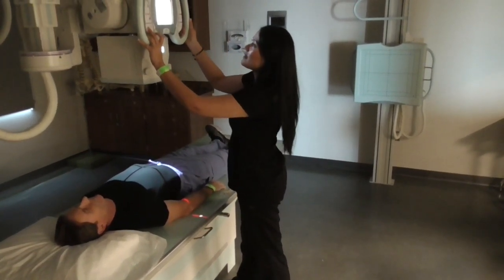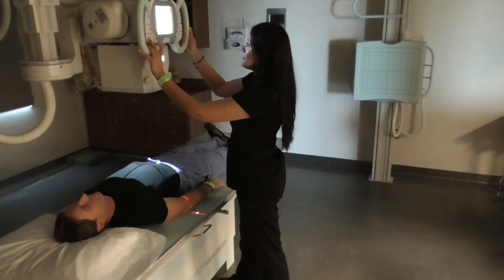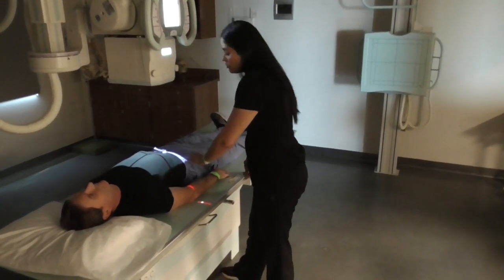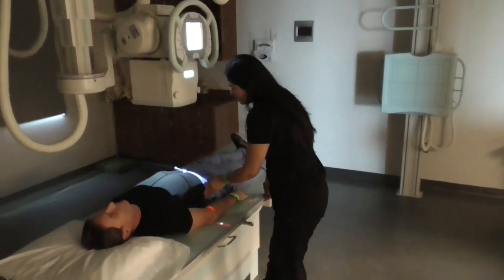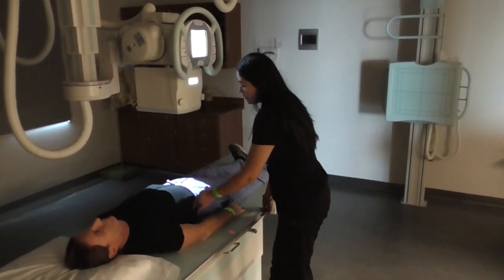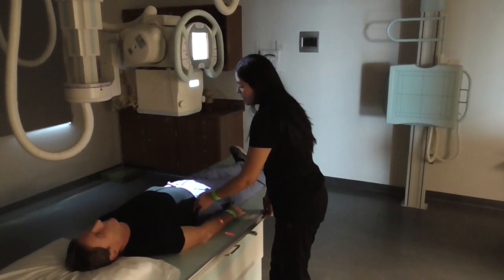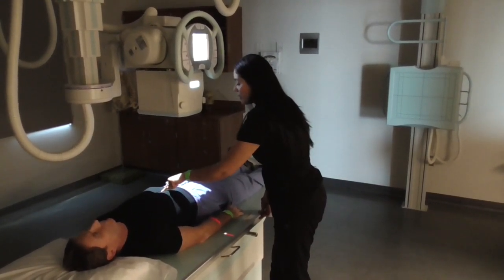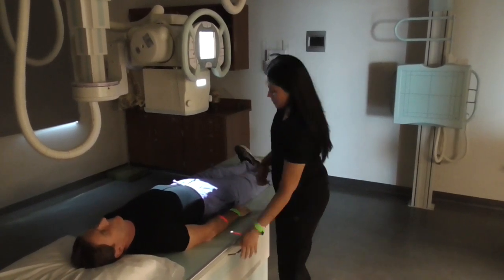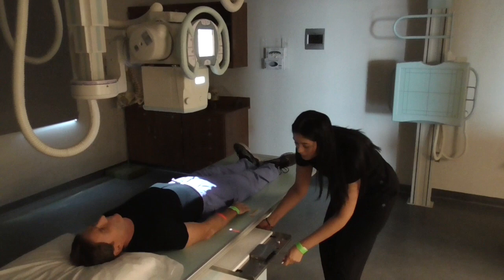I'm bringing my SID down to 40 inches. I'm going to find his iliac crest, which like we said is at the level of L4, right there. Make sure that I'm going down midline as well. Make sure that I'm lined up.